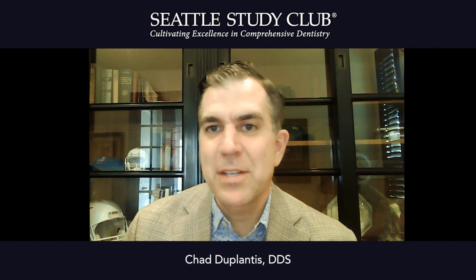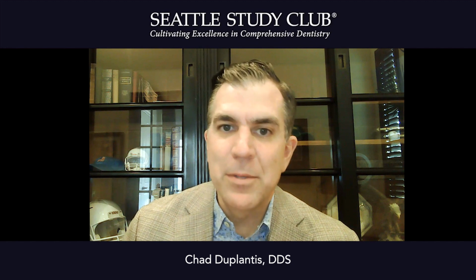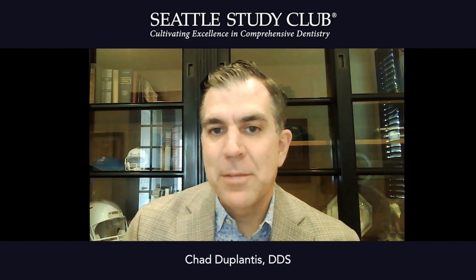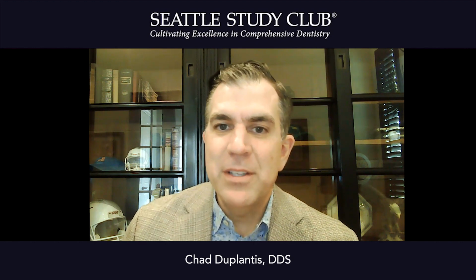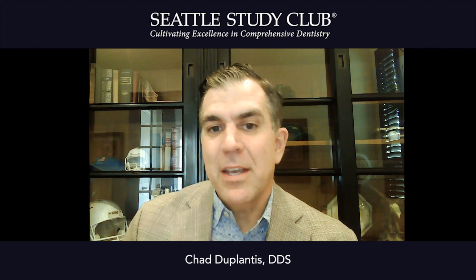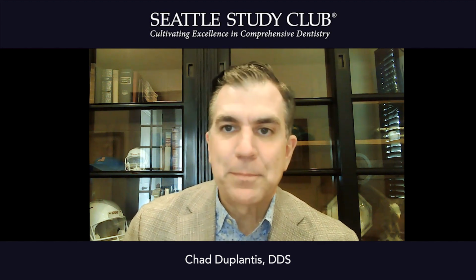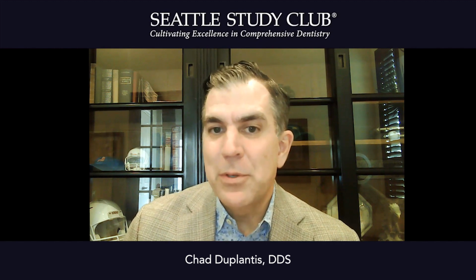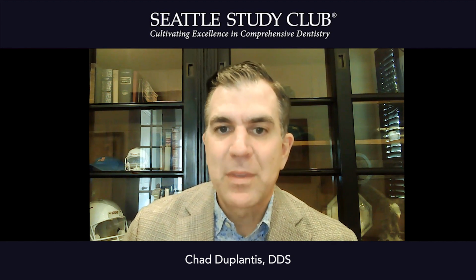And finally, the S stands for segmented arches. I look at both the maxillary and mandibular arch in 6 segments. So 2 posterior segments for each arch and 1 anterior segment for each arch. And that really allows us to zone in on the teeth and the surrounding structures and see if there's any issues within. Once we've incorporated this technique, I promise you it will really help you to interpret and analyze the CBCTs that you take into your practice.